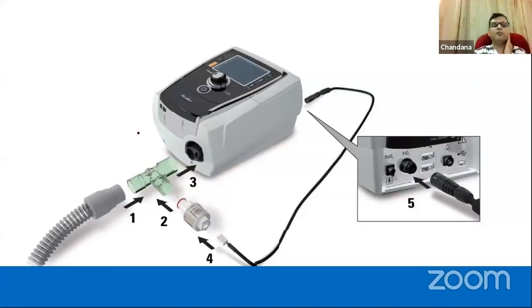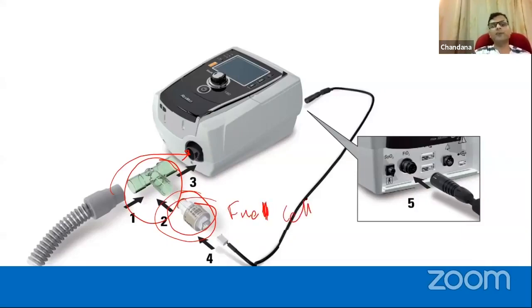If you have an oxygen sensor, please attach it, then you will realize how much oxygen the patient is getting. Most of the time, we actually connect this directly to the device without attaching this one. This oxygen sensor, which is called a fuel cell, is kind of expensive, and you can attach it to the back of the device, called FiO2. There is a cable, you attach that end to that end, and the other one to the fuel cell. And with the use of a T segment, you can attach an oxygen sensor. So this is the ideal requirement.